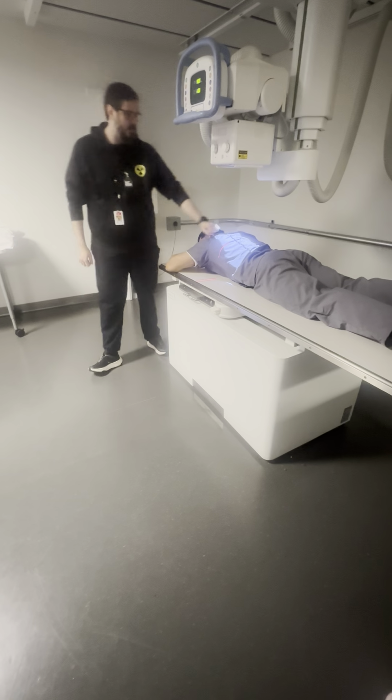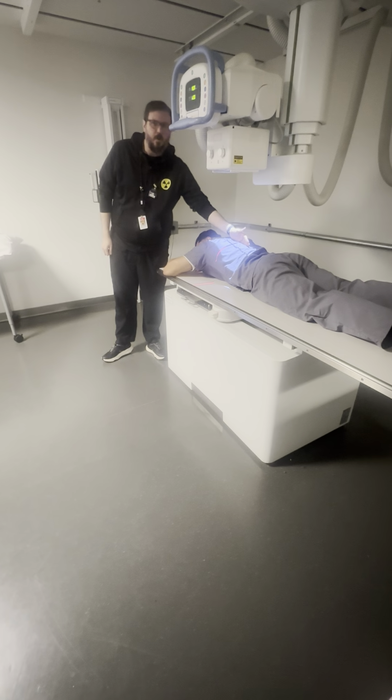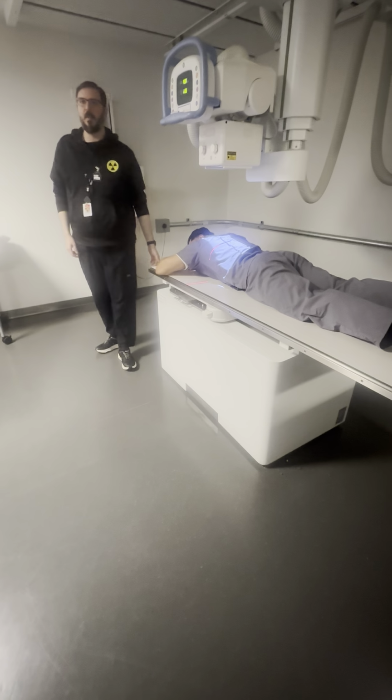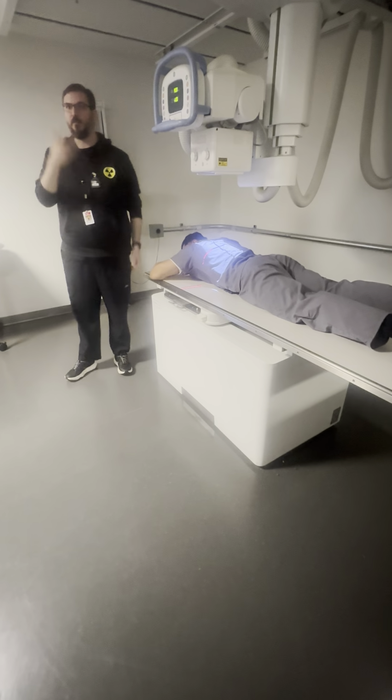Okay, so stomach's right here. Why do I want to keep the spine included in my image? Why don't I just clip it out? The reference point? Reference point's nice for me visually. What else?